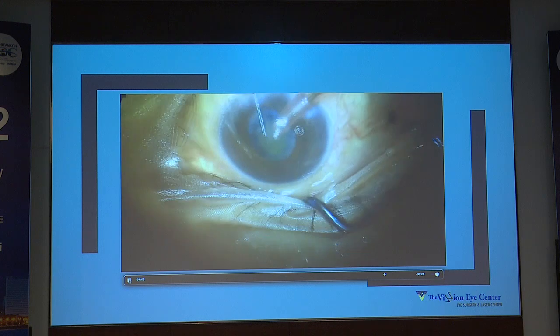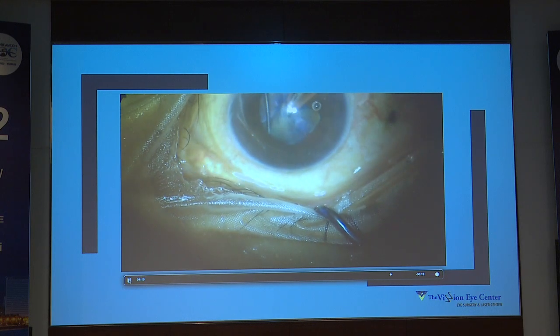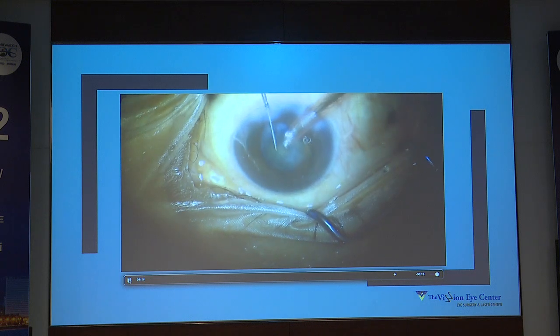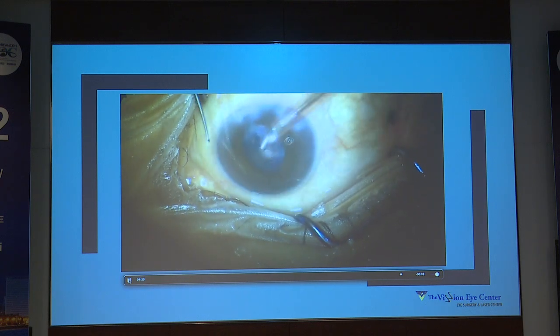All possible techniques that you learn, stop and chop, inside to whatever you wish to do, but this is where you will have to keep moving, debulk, remove fragments, small pieces by pieces. You may not know the extent of the epinucleus also.